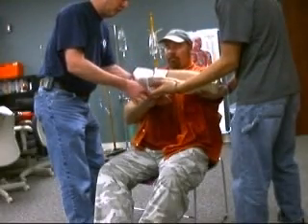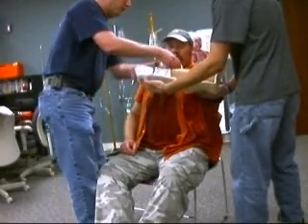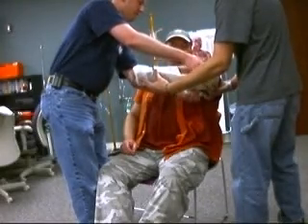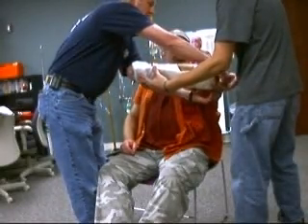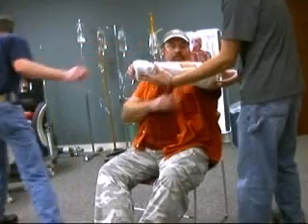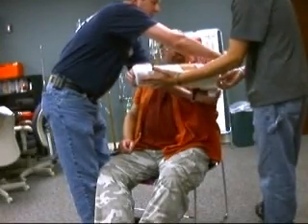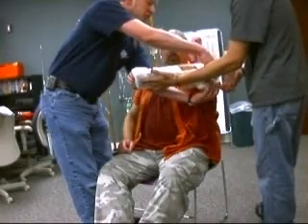I'm going to leave a spot open to check the radial pulse, and I'm going to leave the fracture site exposed so it can be monitored. I'm going to add padding as needed. The splint should immobilize the joint above and below the fracture site — or if this were a joint injury, the bone above and below the joint.